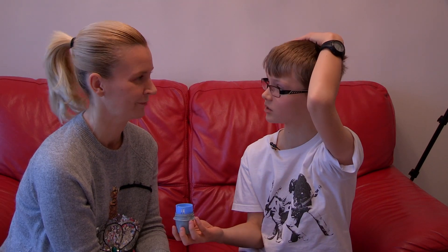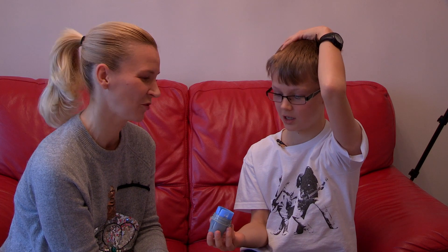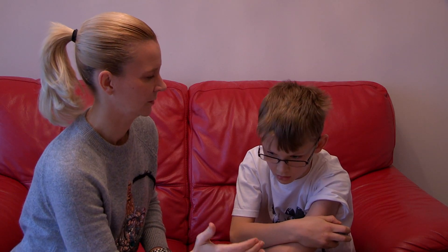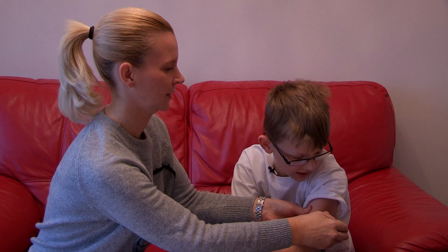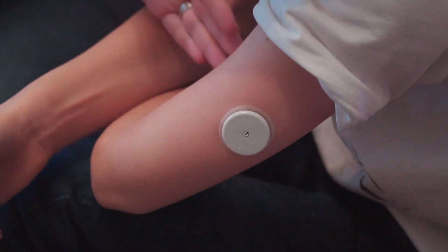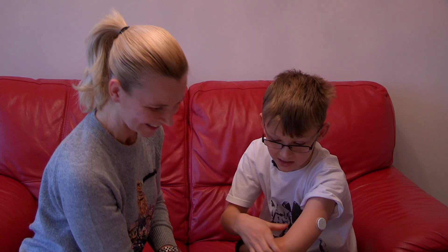Ready to go. You can see the needle there. Does it hurt? We're about to find out. Okay, ready — three, two, one... That did not hurt! Wow, it's on! I've got my sensor on — a Libre sensor on. I actually can't believe it!